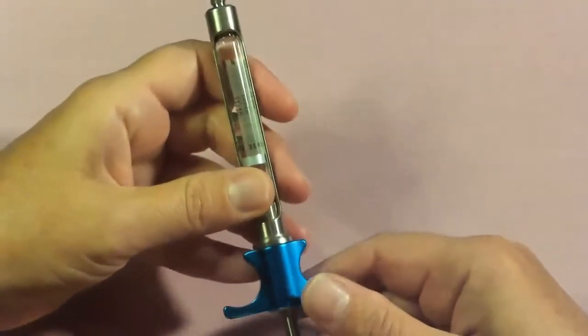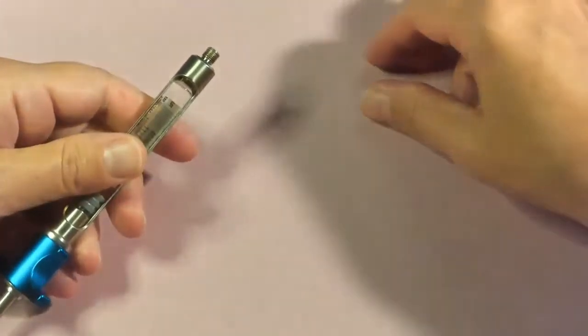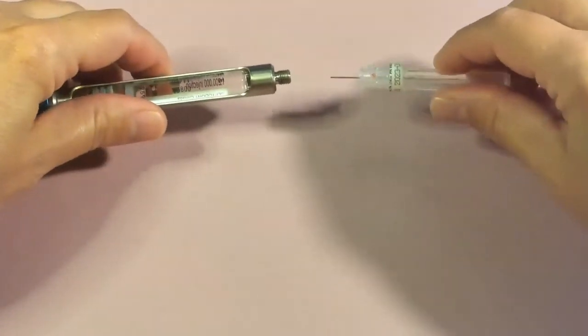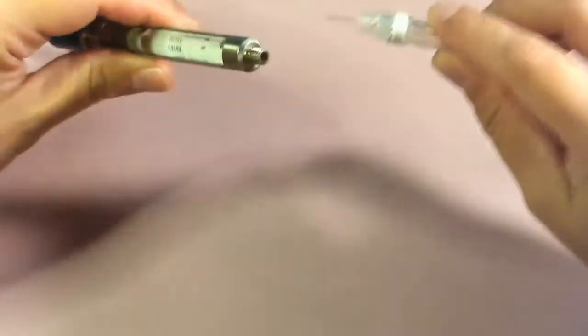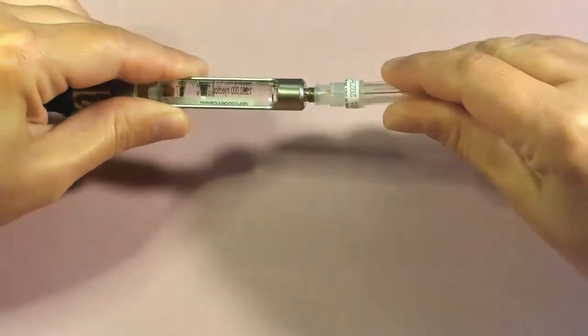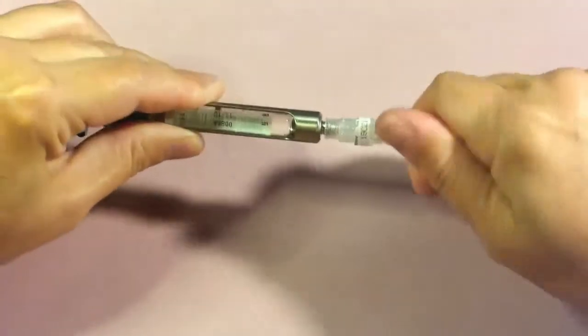At this point we can go ahead and attach our needle. Grab your needle and twist off the end to reveal the needle-penetrating end, or the diaphragm-penetrating end. Insert that as steadily as possible, push firmly down, and then thread the needle on as straight as you can.